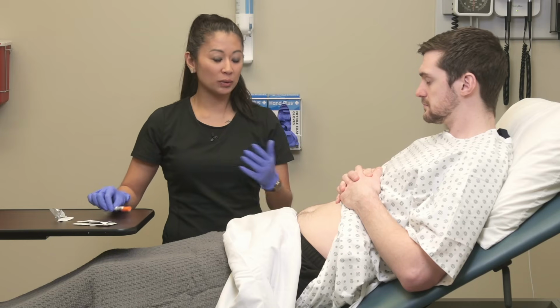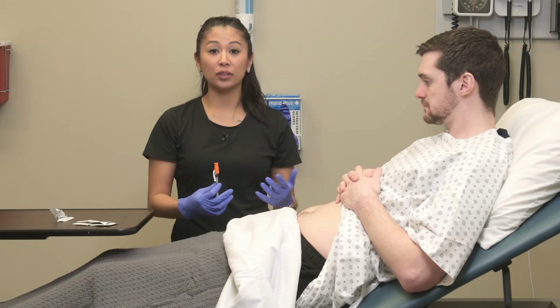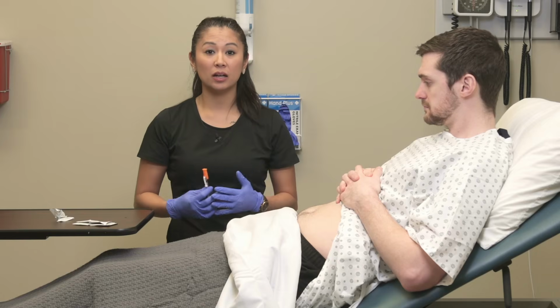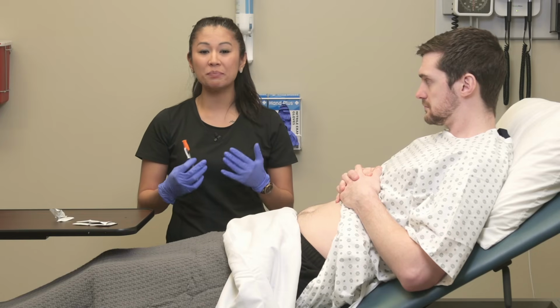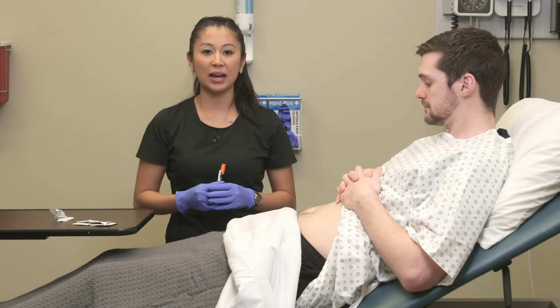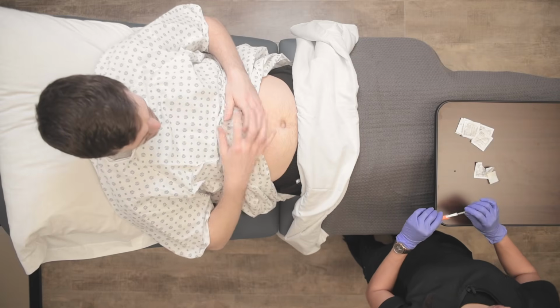All right, so now let's also talk about the angle. Now my patient's at a healthy weight, so here we're going to go at a 90-degree angle. If my patients may be emaciated, malnourished, or have very little adipose tissue, we may need to consider going at a 45-degree angle. But for this demonstration, my patient, we're going to use a 90-degree angle, which is appropriate. All right, so now let's get ready for administration.